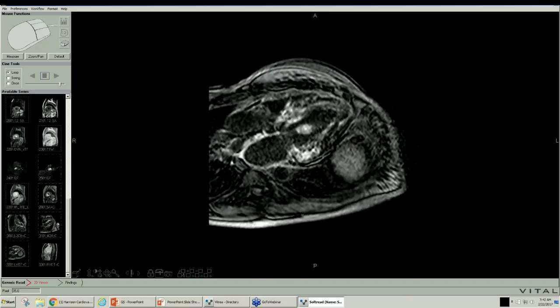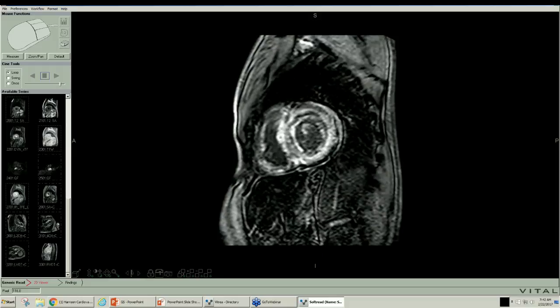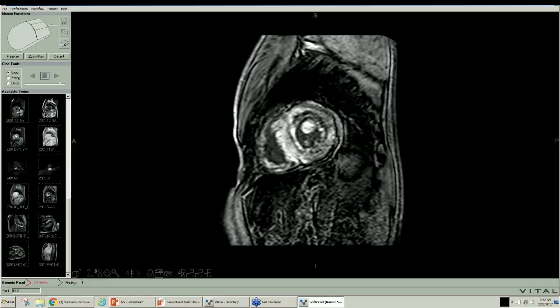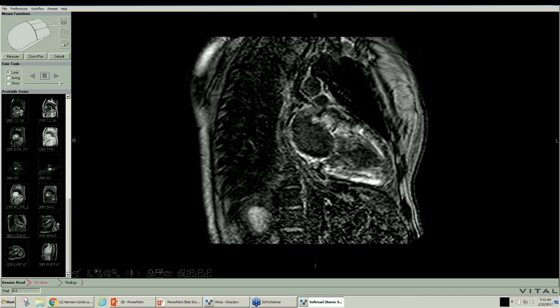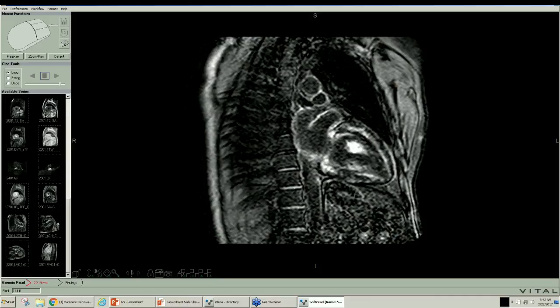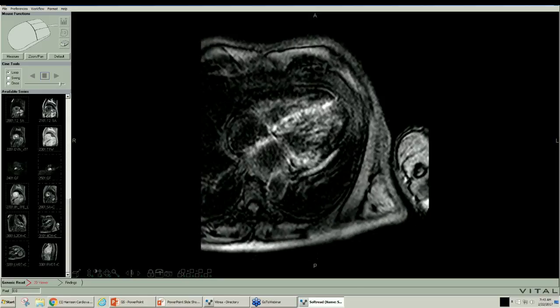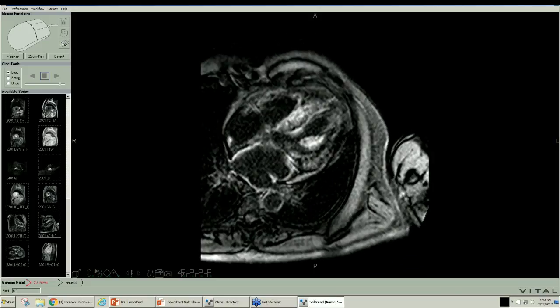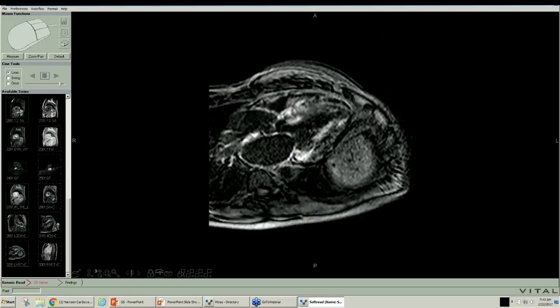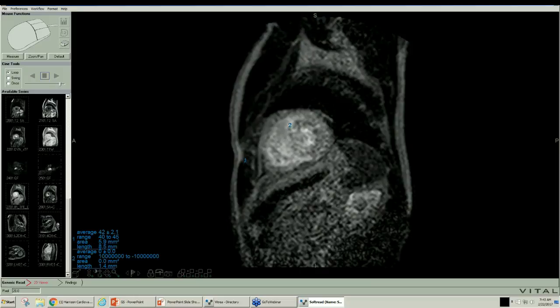So let's look at these carefully, and let's look at the other ones. Here we go. All this white stuff seen in here, this should be totally black, is amyloidosis. How about the right ventricle? Yep, there it is. So that explains the right ventricular thickening because of amyloidosis. So two patients, same day, back-to-back, amyloidosis, and we thought we had a dysfunctional technologist or dysfunctional coil. In fact, our failure to null was that both patients on the Look-Locker had amyloid disease, and now instead of seeing a totally black myocardium, we see all the late gadolinium enhancement seen with amyloid disease. And so now we have a diagnosis. It took a while to get there because of the happenstance of two patients back-to-back coming with amyloid heart disease and our failure to be able to null the left ventricle.